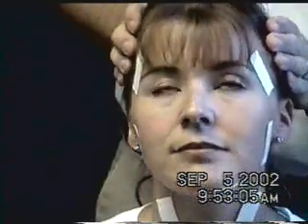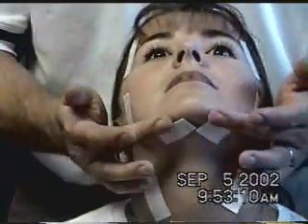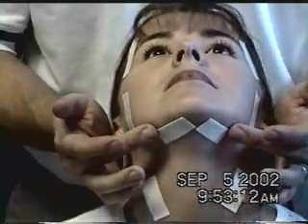The rest of the electrode placement is like this — please look up. You'll notice we have the digastric electrodes here. The easiest way to place these is to simply run them along the ridge of the jawbone.